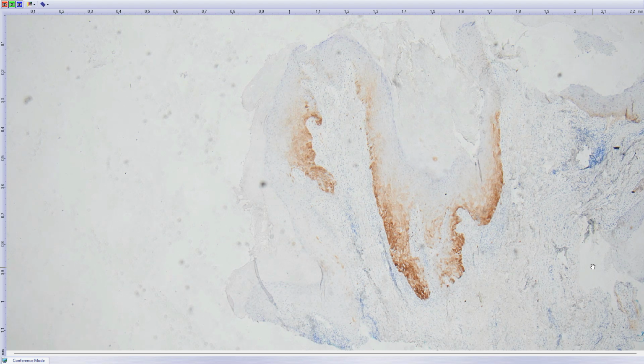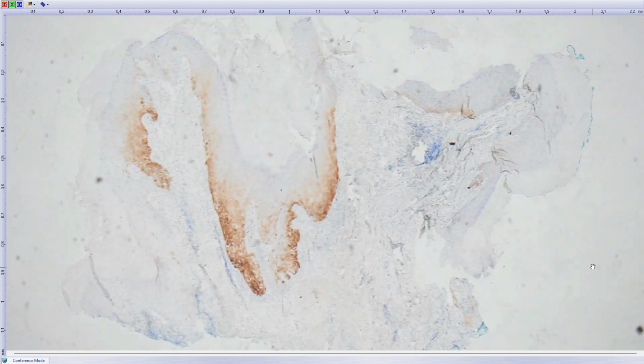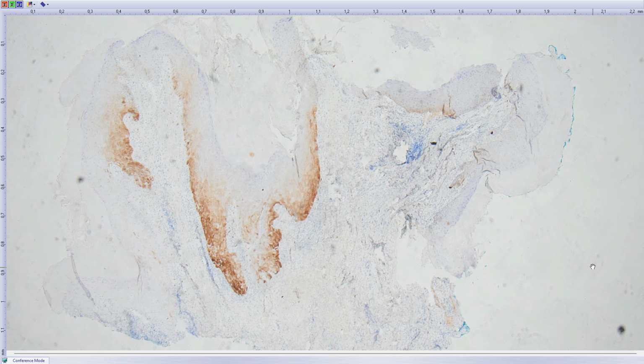We think that the tumor goes the pathway of differentiated type of dysplasia, carcinoma, but at the same time there is infection of HPV, and we see it more and more often, and it is very understandable.